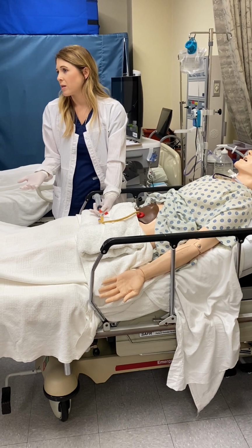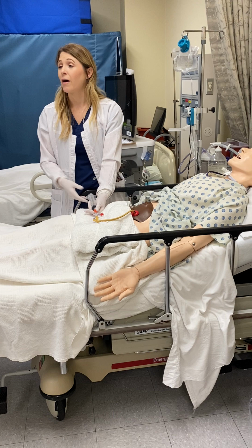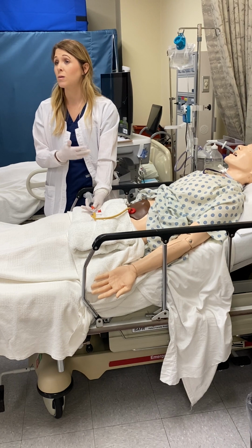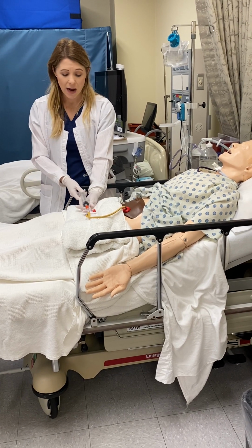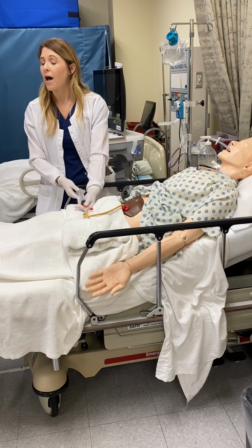No, because then they're not getting the medicine. So we check a residual to make sure that they don't have too much feeding. This is going to be per facility policy, how much they'll allow you to have as a residual and still administer feedings or food or meds. I always go off my own judgment before I'll call the doctor.